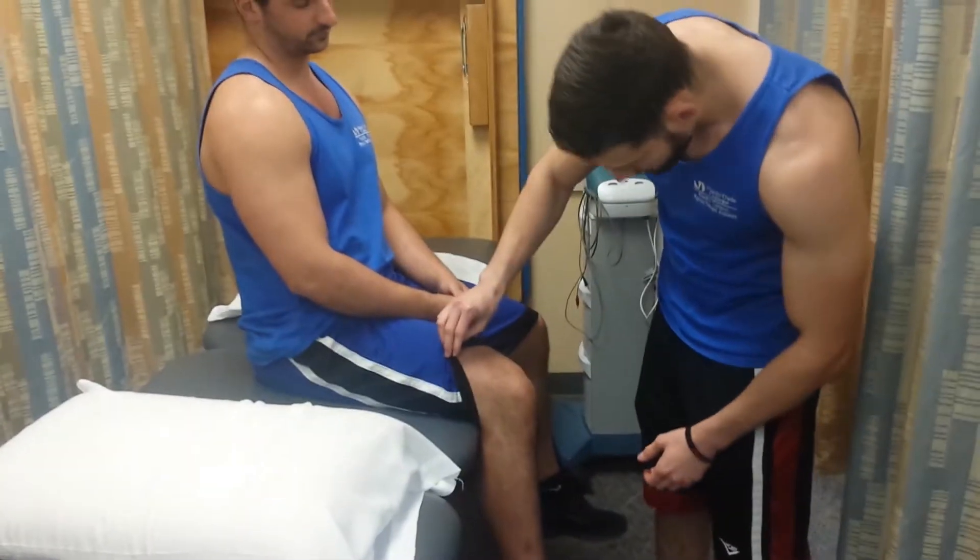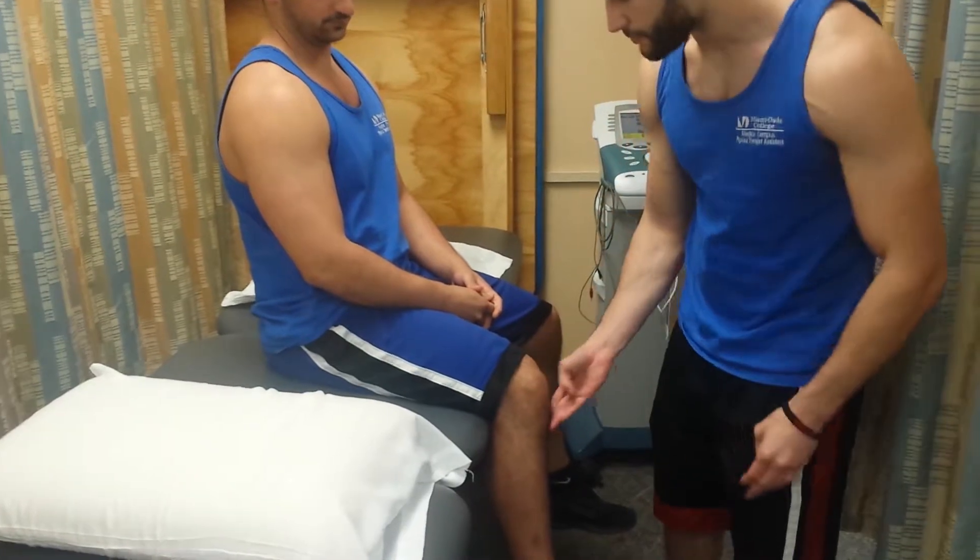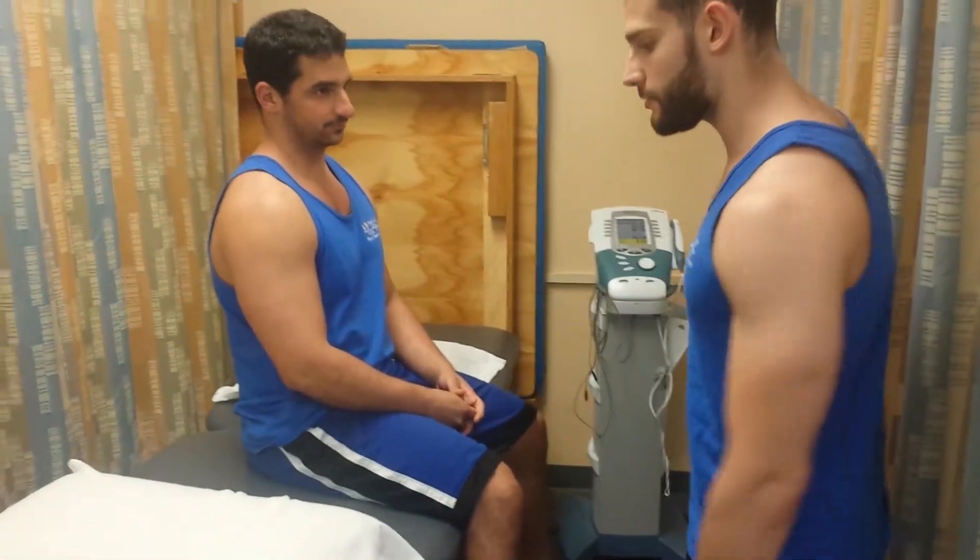So before we start, let me just check out your knee. All right, so you can just lay down and get comfortable.